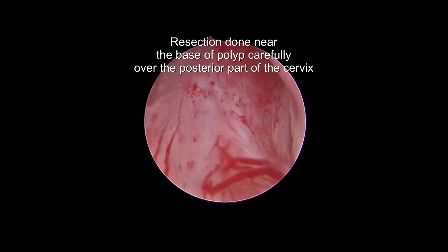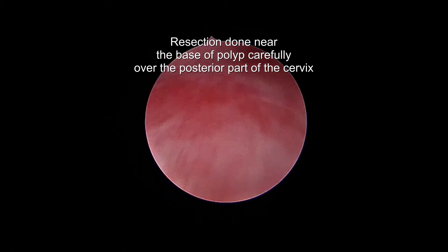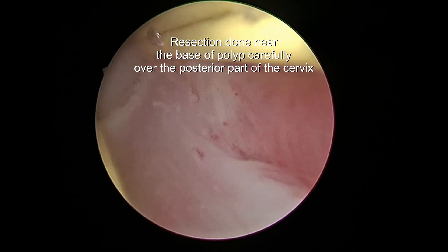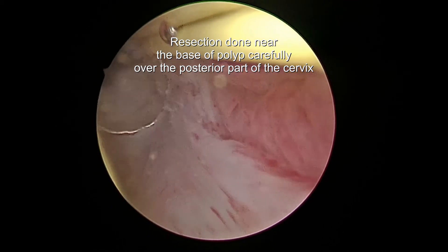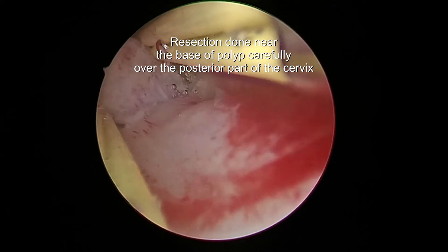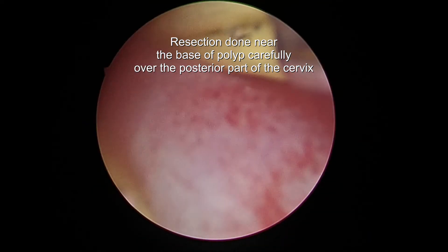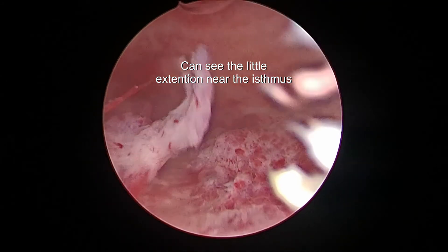You have to offer a treatment where you can do resection. Here we are using a saline bipolar resectoscope. After dilatation, you work carefully — you are not working in the uterine cavity but in the cervix. This is the isthmus; this is the base of the cervical polyp near the isthmus. Start doing resection superficially, otherwise it will cause perforation — be very careful.